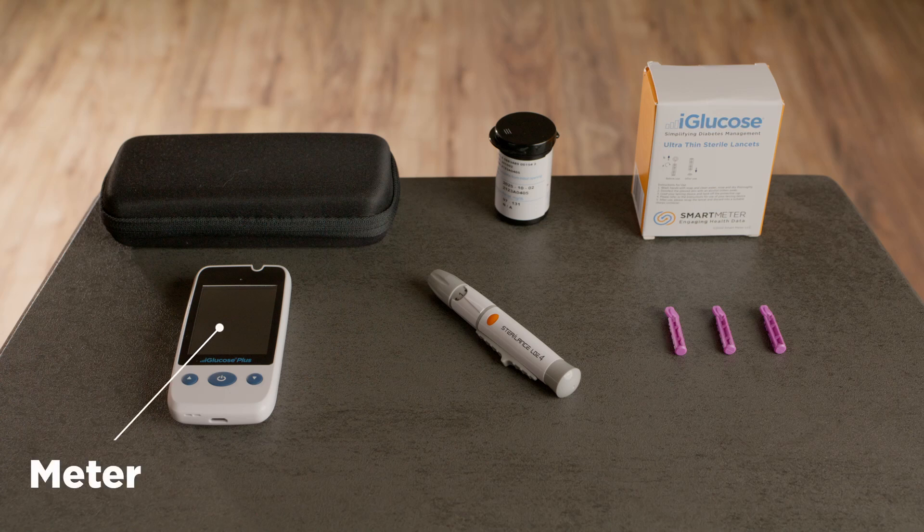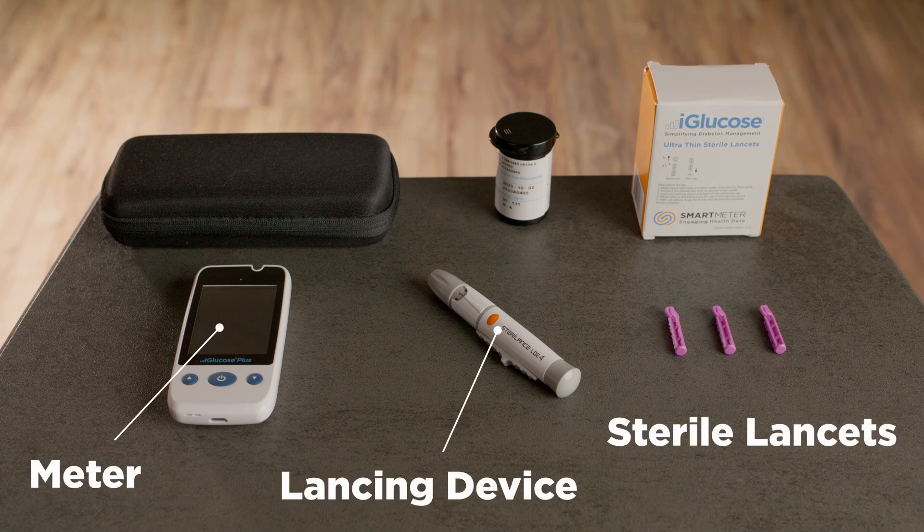Before you start, please wash your hands with soap and water. Be sure to dry thoroughly with a clean paper towel.